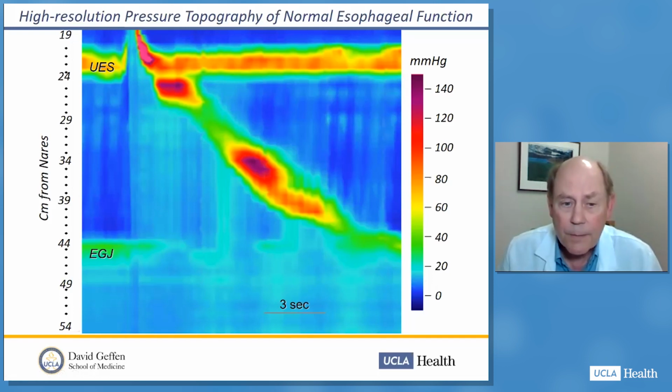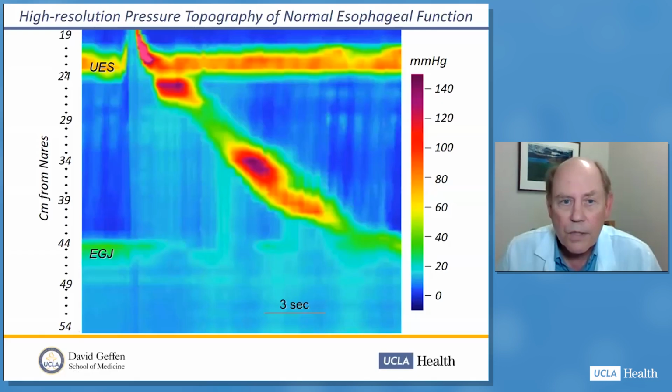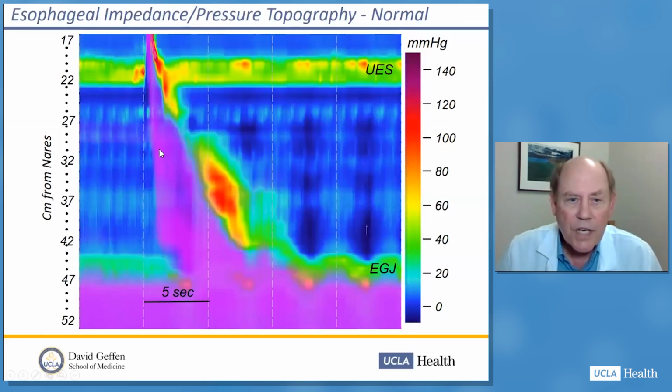Having said that, impedance makes it significantly easier to see if the bolus has cleared. The magenta that you see here is the low impedance in a saline bolus that has been swallowed. And you can see it looks a lot like the image I just showed you where there's a straight line. The bolus is here and the magenta is not here. That means that it's been cleared from the esophagus.